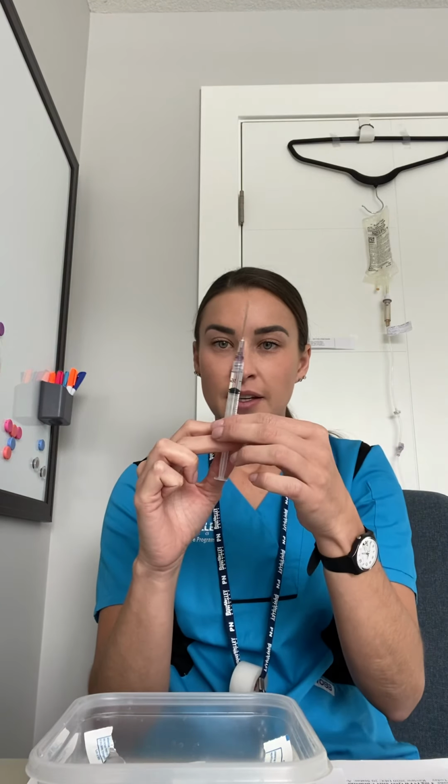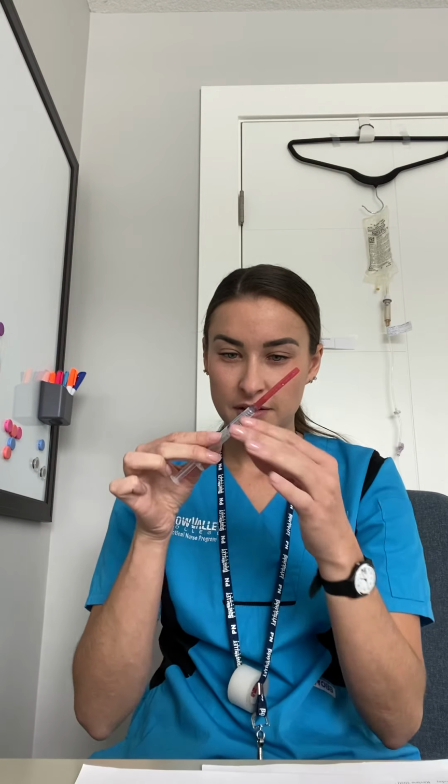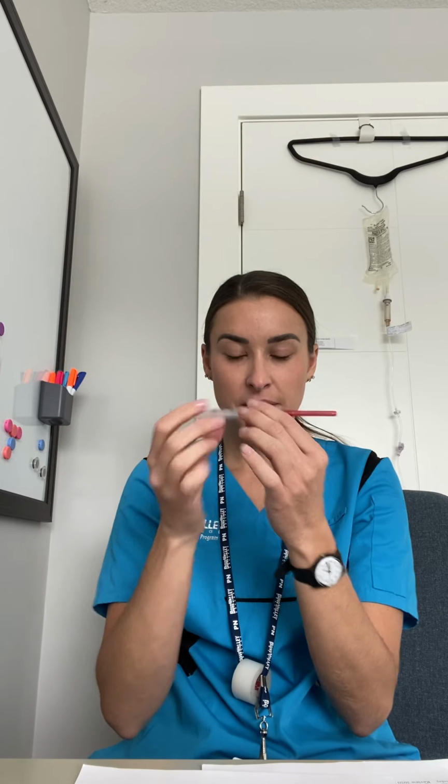Perfect here. And then we can recap here, and we want to recap safely using the sharps container. This one's kind of flimsy, so, and want to make sure there's, I see a bubble. Usually one tap is best instead of a bunch of small taps, but work for me.